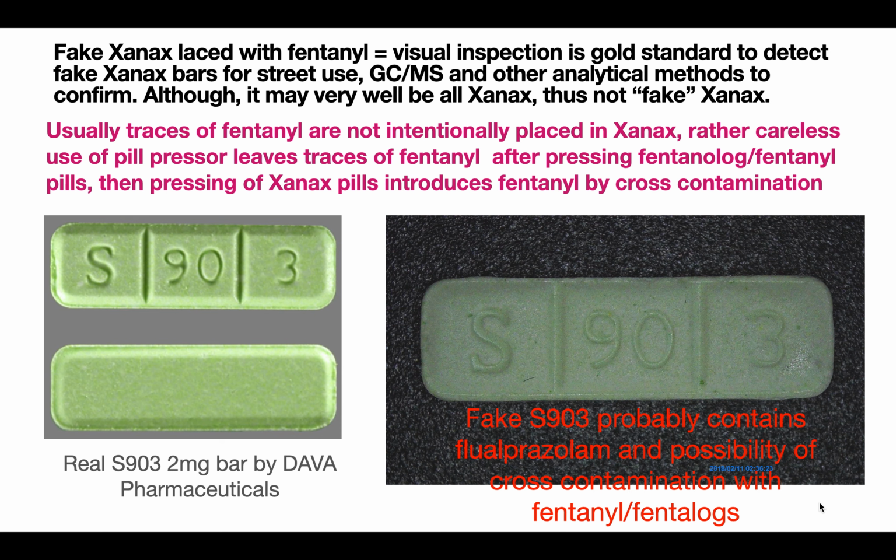Now notice how even under the microscope, how good this pill presser is. You can hardly tell the difference. The only giveaway really, pill examination is the number one standard, especially for street use to determine real or fake pill.